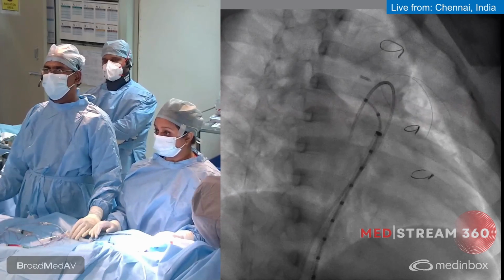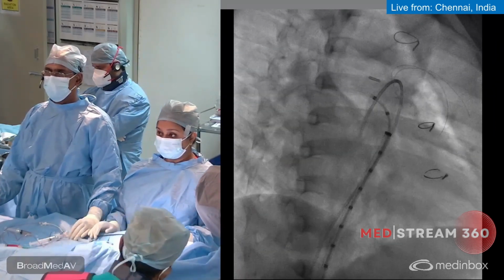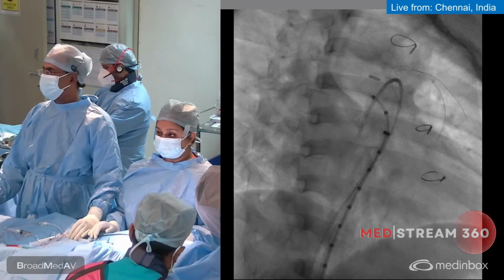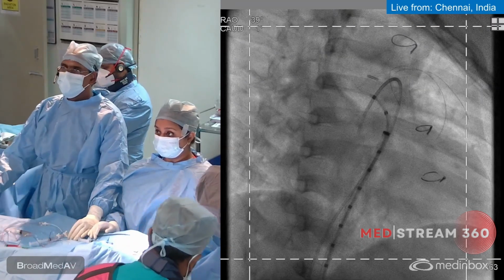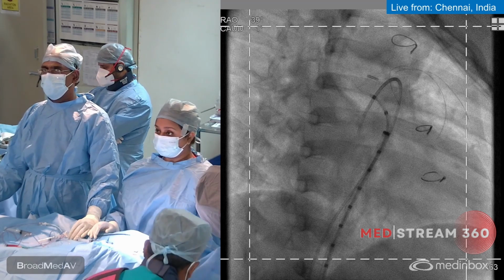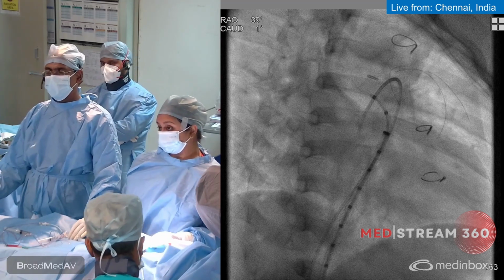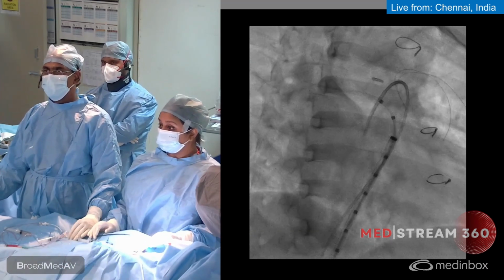Yeah, that's enough. That's enough. Collimate a little bit. Nicely collimate. So what's the weight of this patient? 25. Yeah, 15 ml at 15 rate should be sufficient.